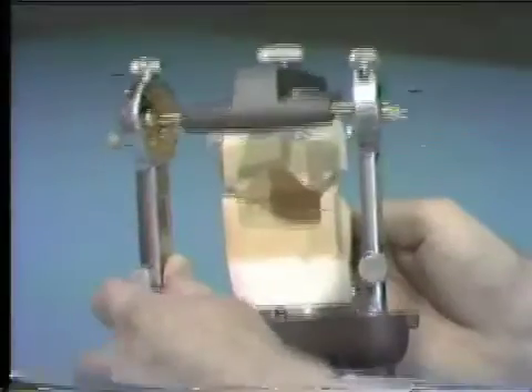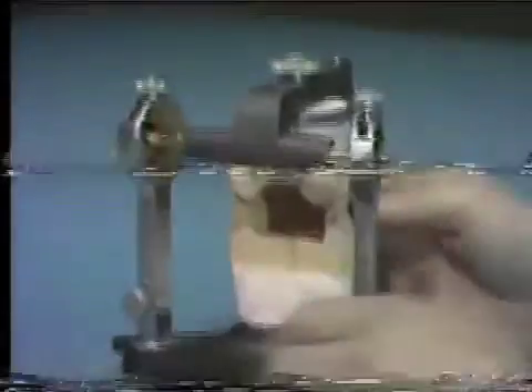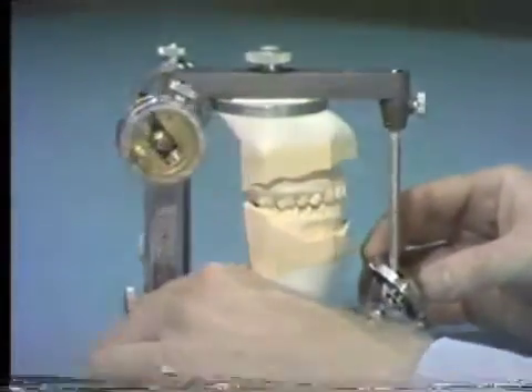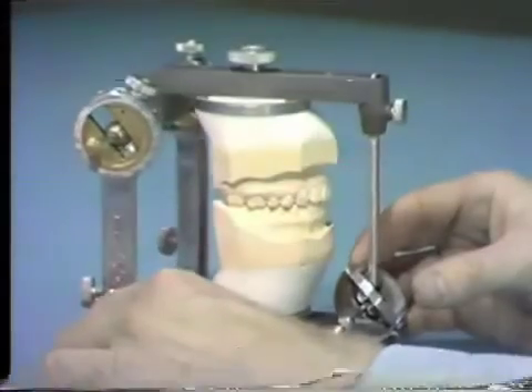Balancing side contacts are not desirable and should be eliminated during the diagnostic waxing. The left working and right balancing movements should be examined on your own cast, even though time does not permit for such a thorough examination on this recording.